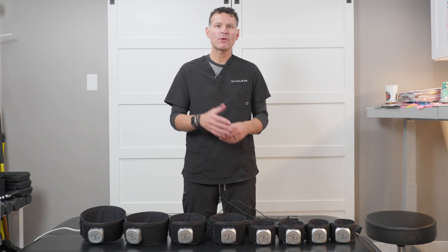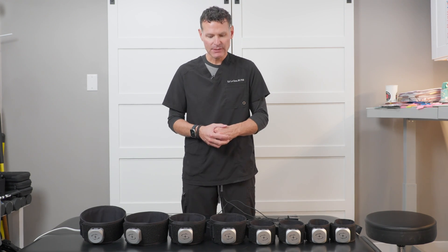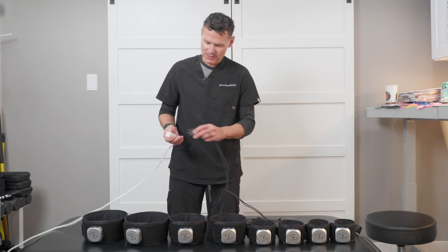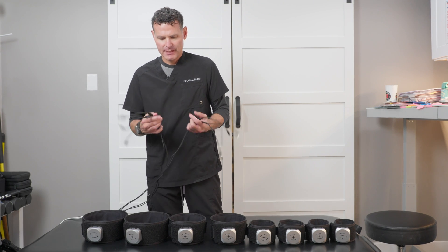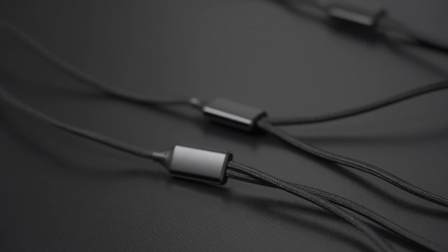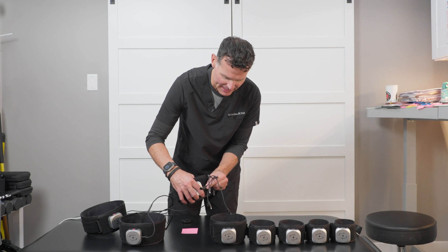The first thing I want you to do when you get your cuffs is to plug them all in. I'm going to demonstrate how I do that — I use an extension cord and just plug these in. The cords we send can get them all going at the same time. You really want to make sure these are charged first before you do anything else.